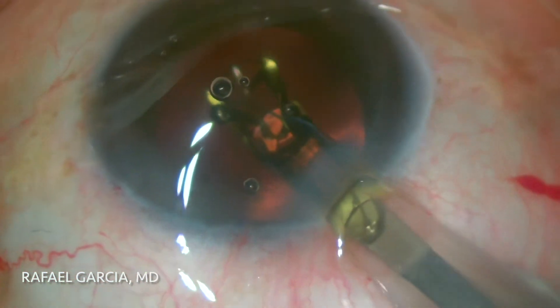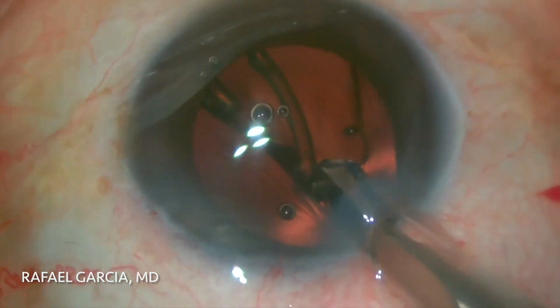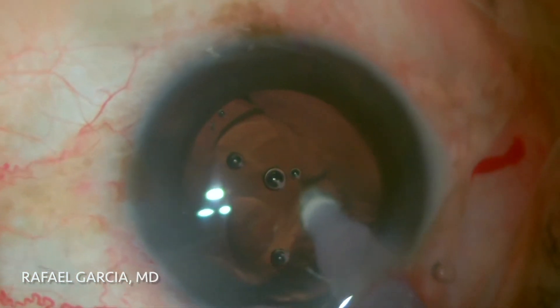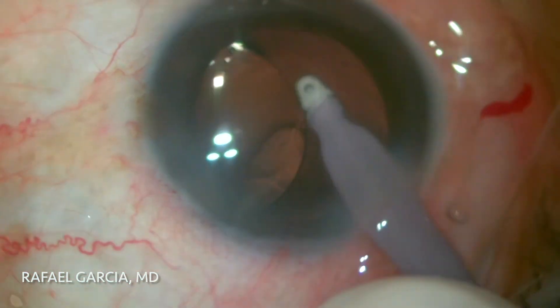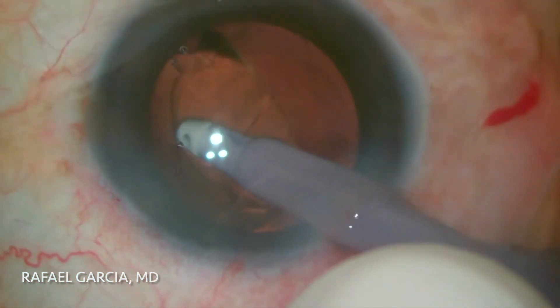Now it's time to load and implant the lens. Note how nicely and smoothly it unfolds in the capsular bag. The chopper is used to properly position the trailing haptic and center up the lens. The viscoelastic is then carefully removed from behind the IOL — this is an important step to avoid lens rotation, especially when it's a toric IOL such as this one.